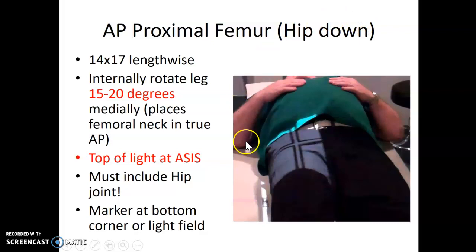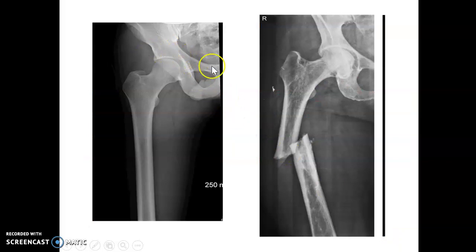For AP proximal femur, you're going to go hip down. Patient supine, you're going to use your 14-17 cassette lengthwise. They're going to internally rotate their legs 15 to 20 degrees, so you make a little triangle with their toes. I place the top of my light at ASIS and put my marker at the bottom point of my light field — this helps when you need to overlap images. Essentially you need to get the hip joint down as far as you can on the image. The toes are rotated in to decrease the lesser trochanter.